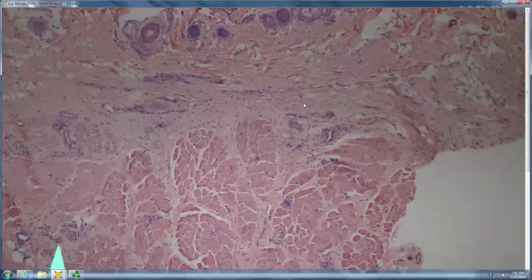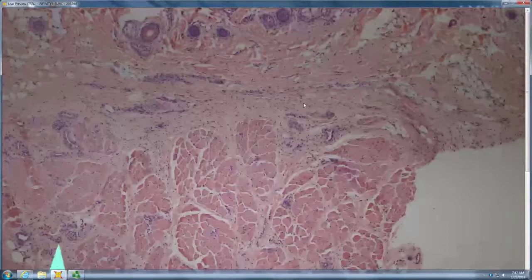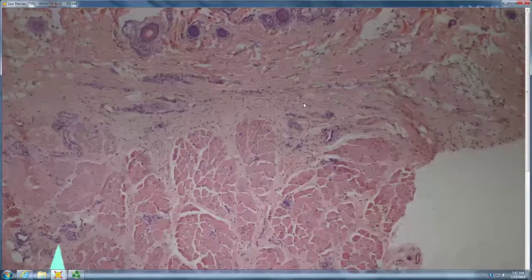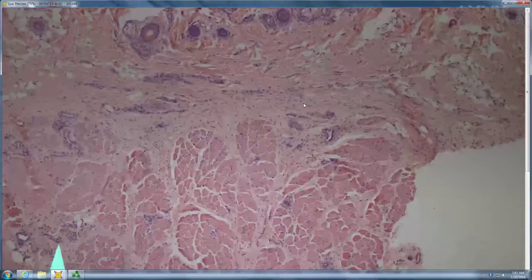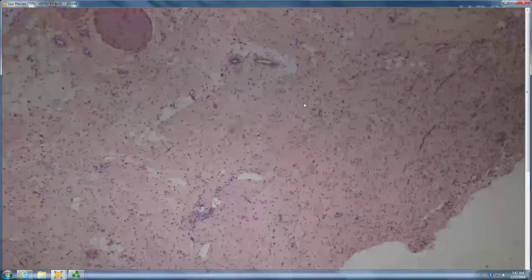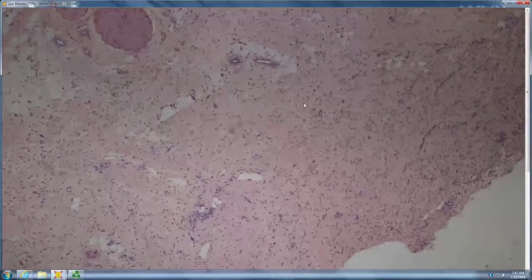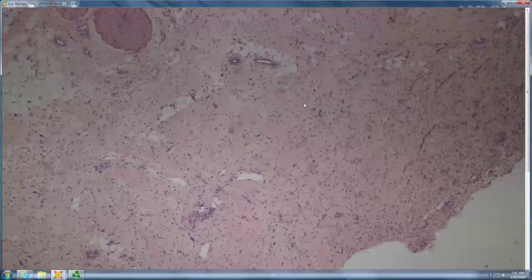It's probably a hairy animal whose coat does not continue to grow, but has a seasonal growth and then stays the same length because they're all telogen. Either it's a very hairy dolphin, or more likely a monkey in this case. So that's African histo. But African histo and Lobo, they're about the same size. You can get some pop beads in African histo. On culture, it has tuberculate macroconidia. It grows as histo in culture, whereas Lobo you typically can't grow in culture. So histo actually grows pretty easily.